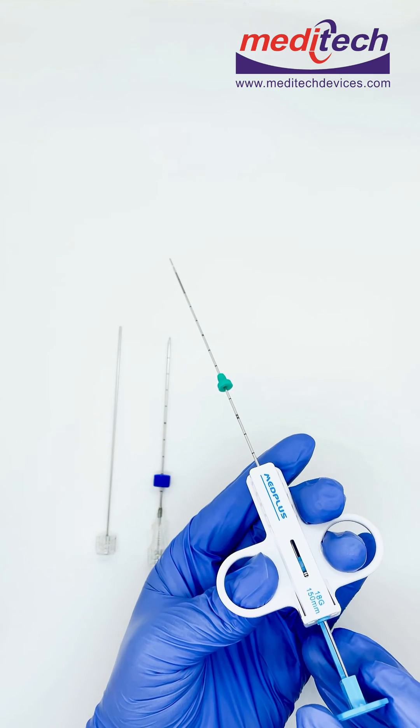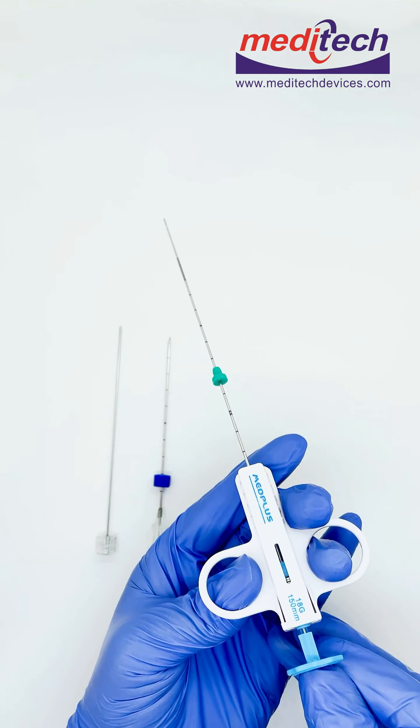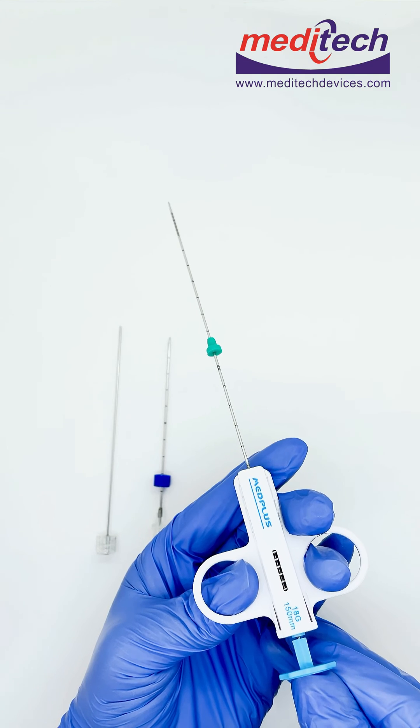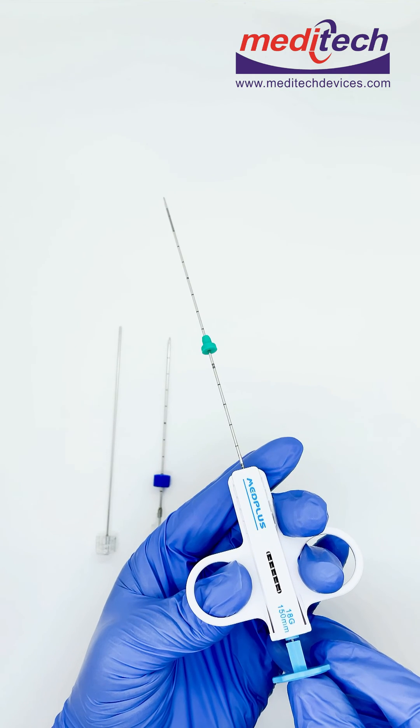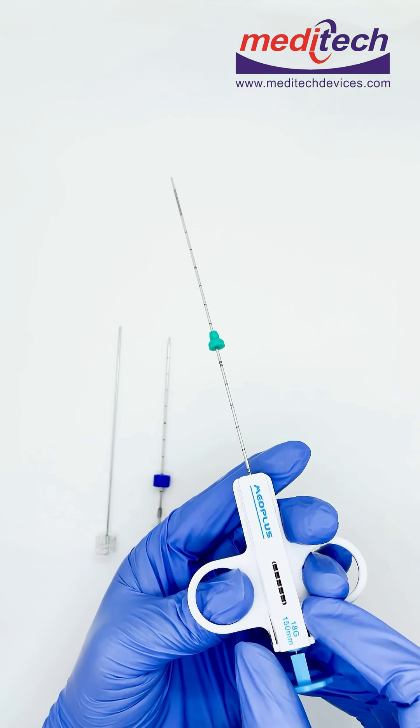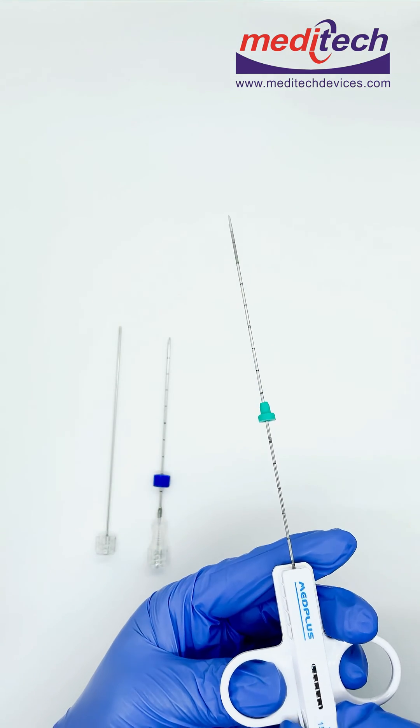You have to hold like this, go inside and push. Now the instrument is fired, so the sample is now inside the needle. You have to remove the needle from the body.